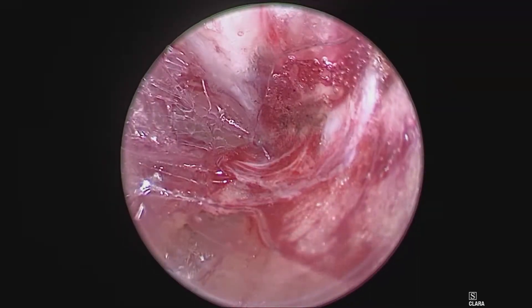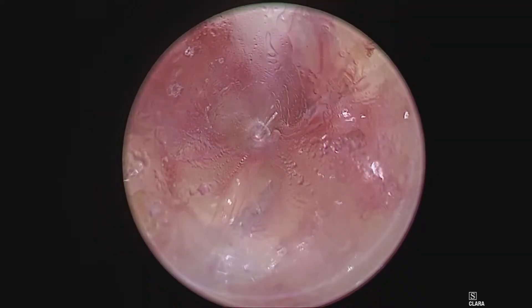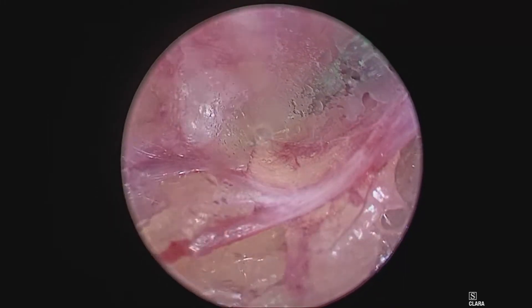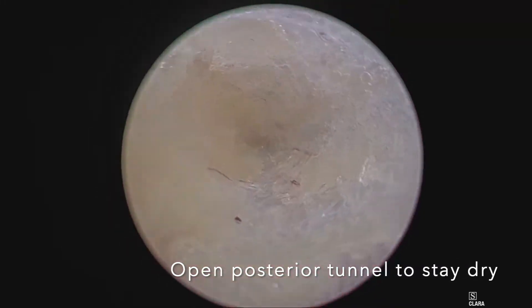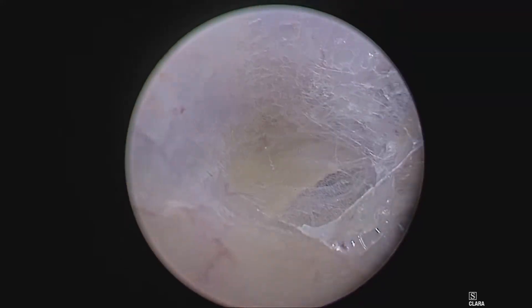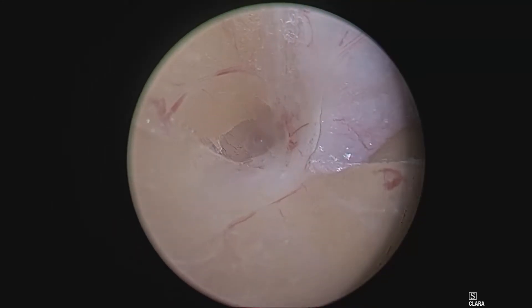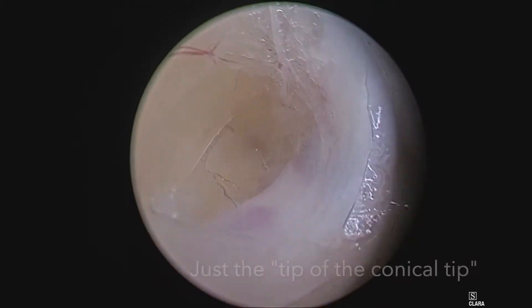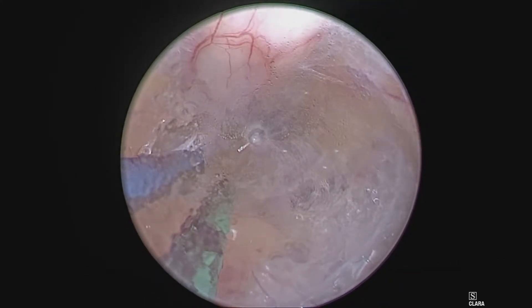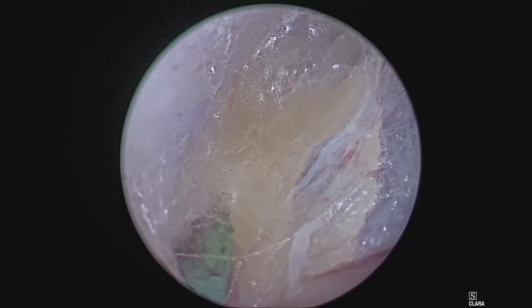Be mindful of your scope and where the window is for the blades to come out. In this case, I'm rotating it away from this small vessel to avoid potentially tearing it — cauterizing and cutting it with the blades. Now I continue my posterior dissection exactly at 6 o'clock. I've identified the last branch, the large medial branch, and I make a small window with just the tip of the conical tip. I send my blades out halfway across the entire vessel, close on it, and engage my cautery.